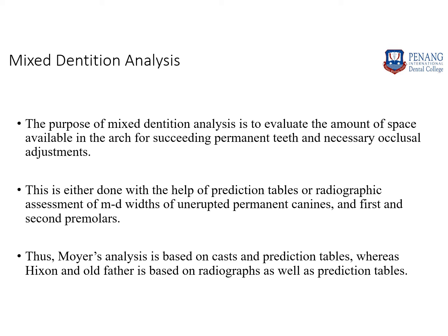It will also help you to assess the mesiodistal widths of unerupted permanent canines, first and second premolars. These are basically done using something called prediction tables, or you can perform them on a cast or on a radiograph and compare them with the values on a prediction table. So there are several mixed dentition analyses you can perform.